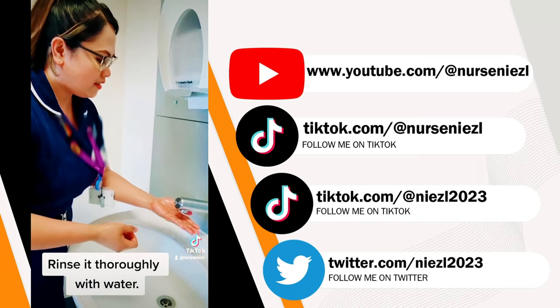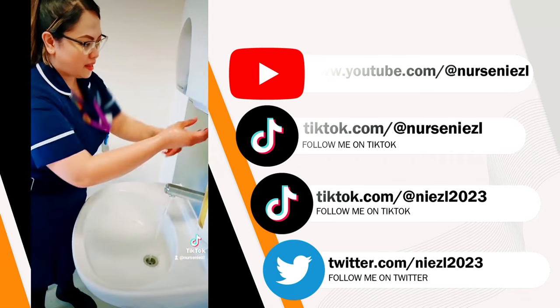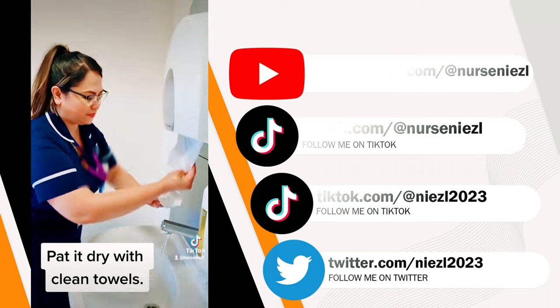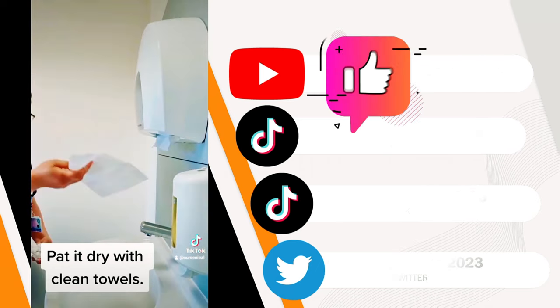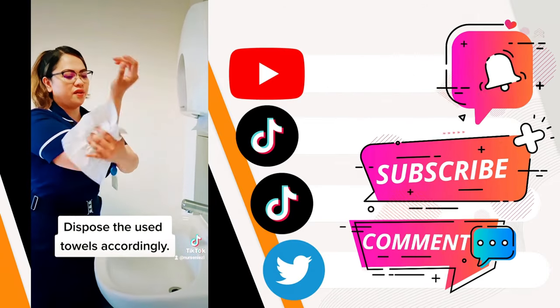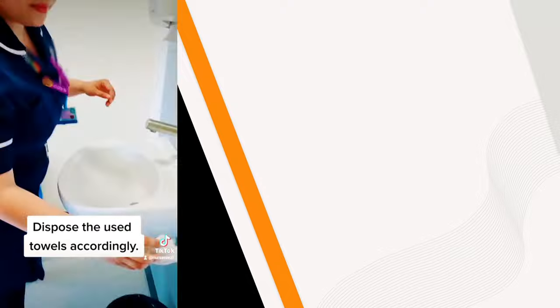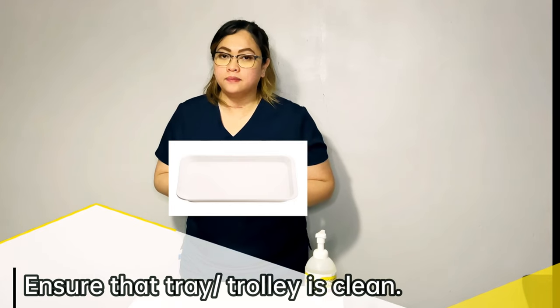Rinse it thoroughly with water and then pat it dry with clean towels. Dispose of it in the domestic bin. Assuming that this is a disposable tray; if it's a non-disposable tray, then you have to clean it with clean wipes, okay?